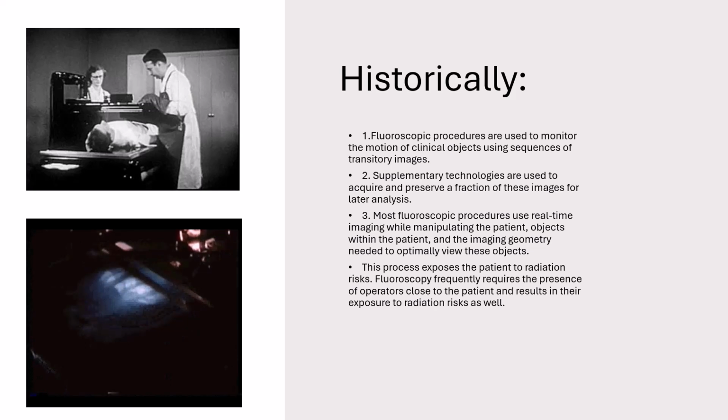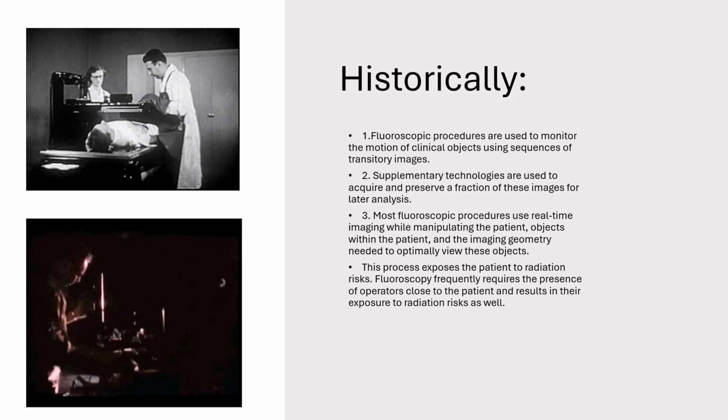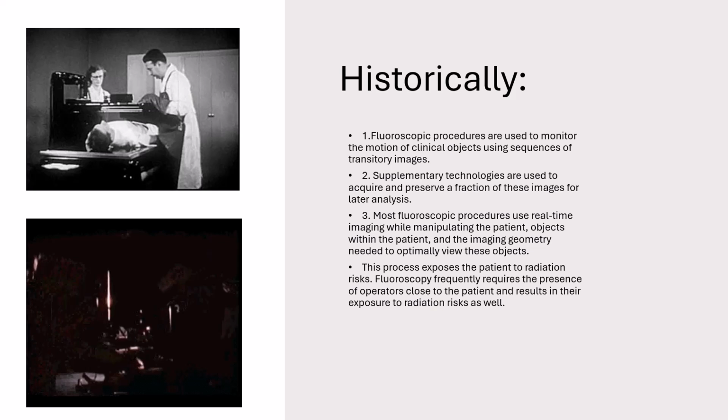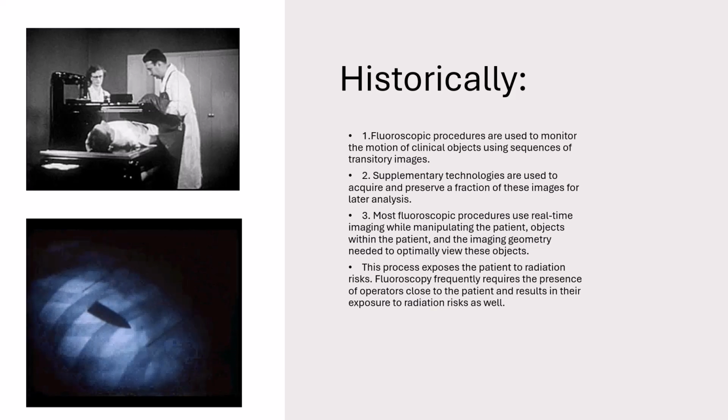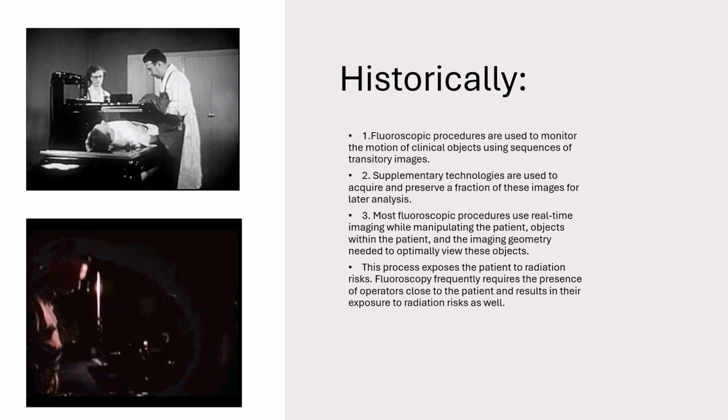Fluoroscopy frequently requires the presence of operators being close to the patient, which results in their exposure to radiation as well as the patient's.